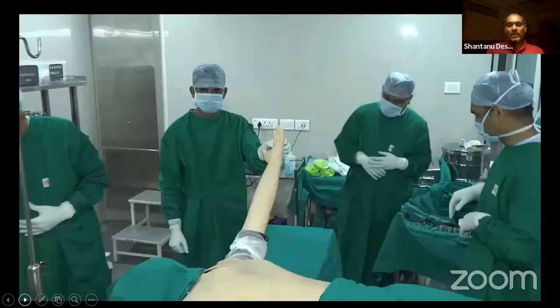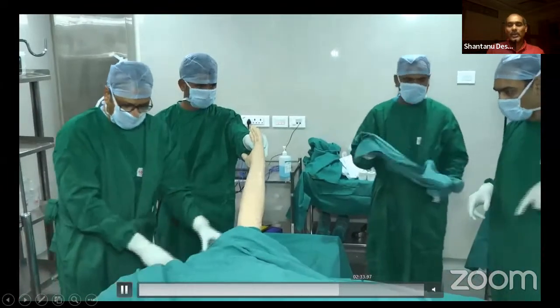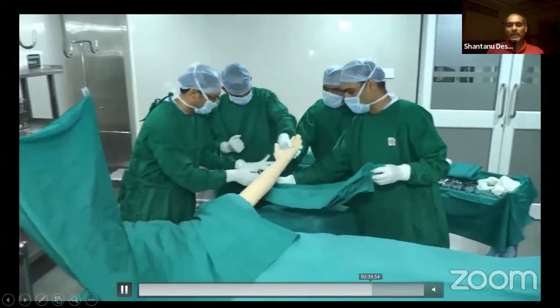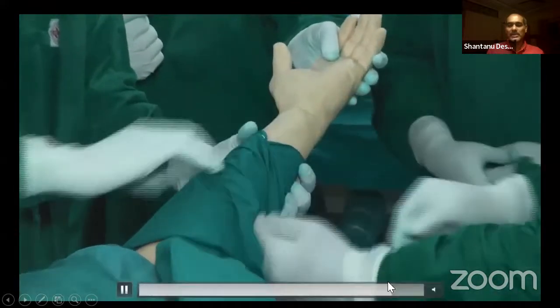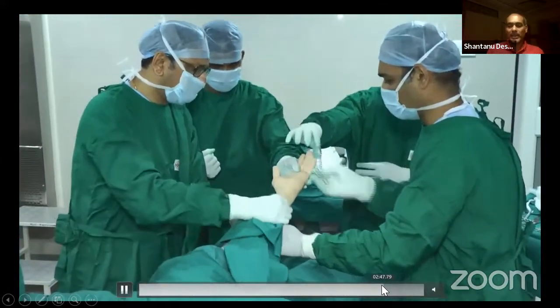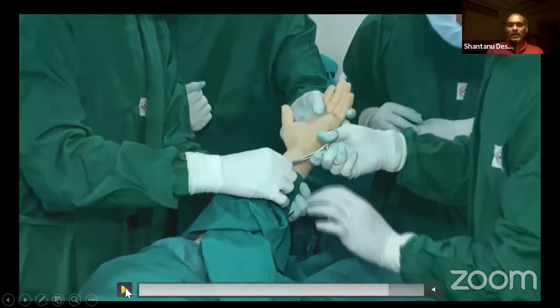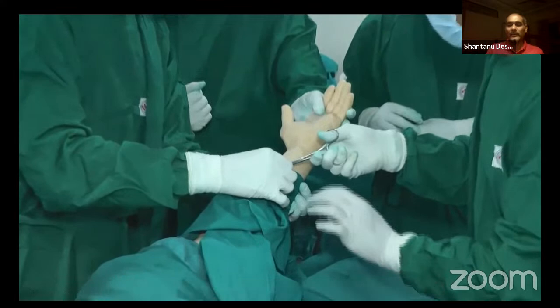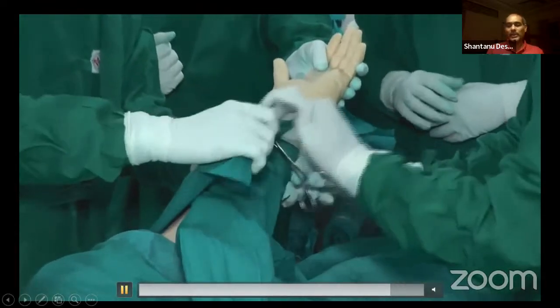So, for the wrist and the hand, you can isolate different areas and check. Most of the areas remain the same. The draping technique remains the same, except if you're operating on the hand and the fingers, then the extra drape is taken to cover the middle third of the forearm, going up to the tourniquet.